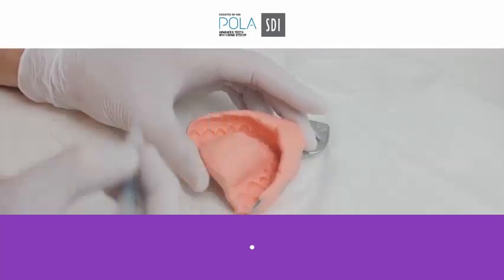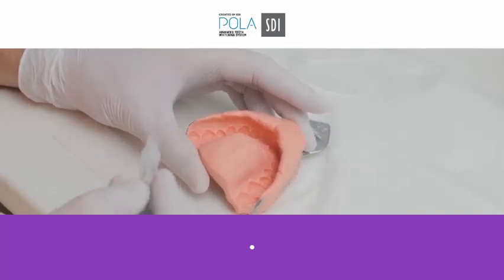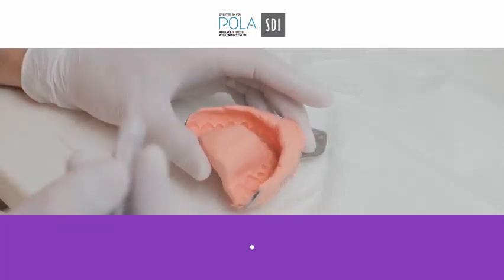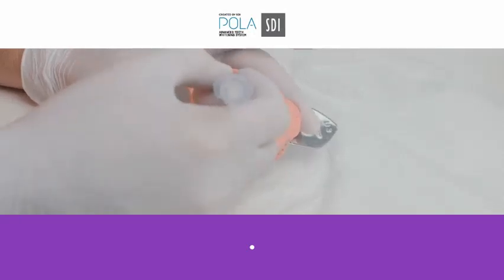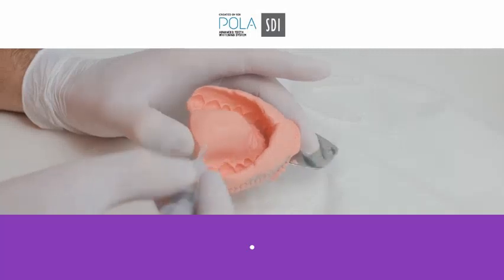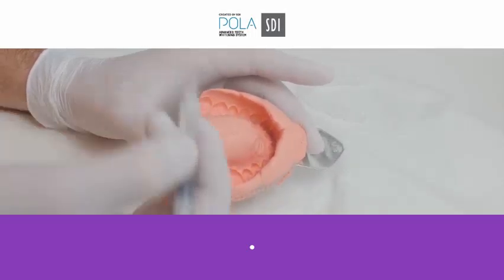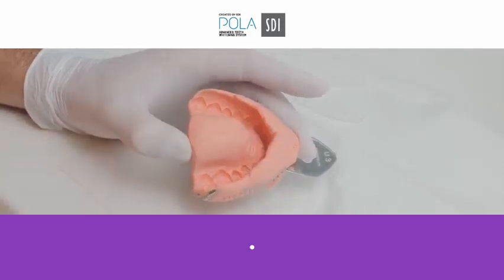When I was lecturing at Manchester University, something clicked, a little bit of understanding of why you're taking an impression and what the actual function of that impression is over the longevity of what you're doing. So when I'm whitening, realistically, I'm only really going to whiten from the 5, if not just the 4 forwards. I will avoid the 6s and 7s, so you don't per se need the impression of those. Obviously, as an impression goes, we'll get the 6 in, but if you cut a tooth off at the back there, does it really matter? Because you're not going to be whitening those teeth, so you're not going to be putting gels in those.